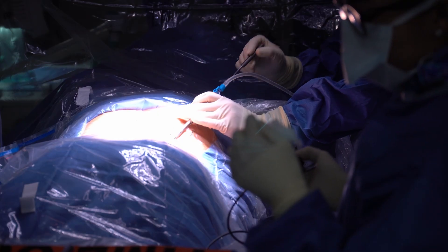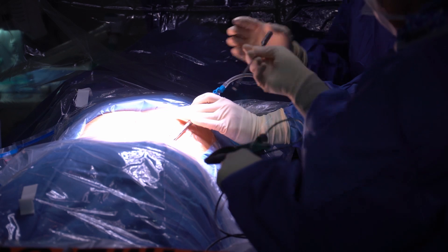There's a whole spectrum of surgical techniques — from traditional spine surgery, which involves an open incision and really removing the soft tissues to directly see the spine, to minimally invasive techniques which involve less muscle damage but still an open incision, to the next iteration called endoscopic surgery, often called ultra minimally invasive surgery, which uses a camera through an extremely small incision.